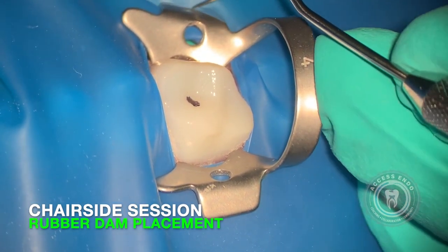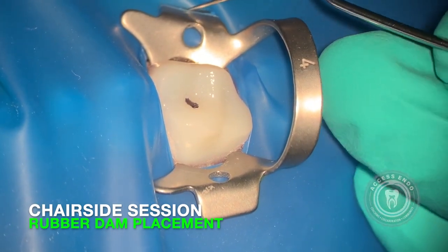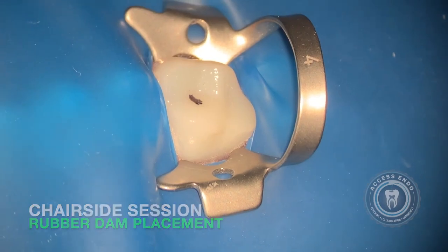You can see it got caught there a little bit, so I'll come back and just nudge it off. Sometimes it takes a little bit of effort or it gets caught like this — you can kind of get under it and flip it back like that. And now we've got our rubber dam in place nicely.